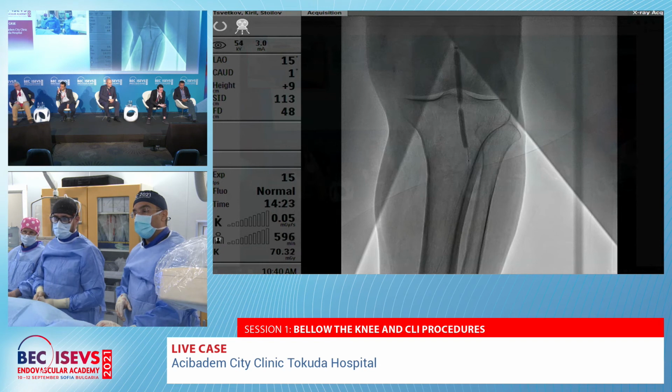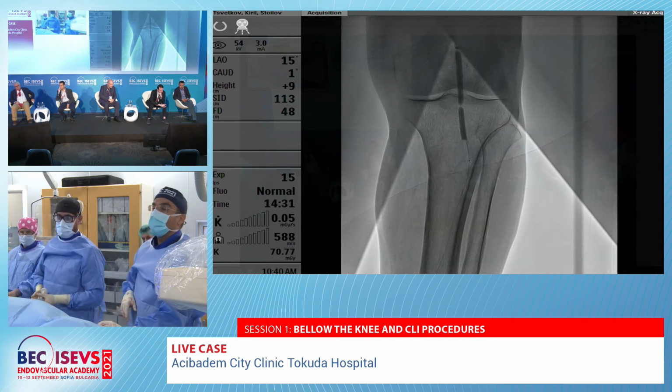Look at this. This is the stenosis at that level. Yeah. That might be some error. Hold some air. I don't know. Let's try. It's possible. Let me get the air out. Okay. Let's try again.